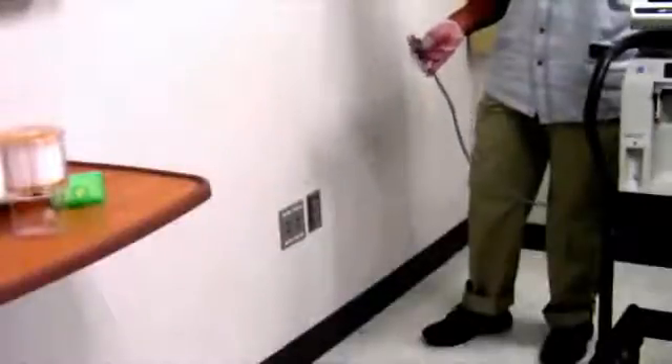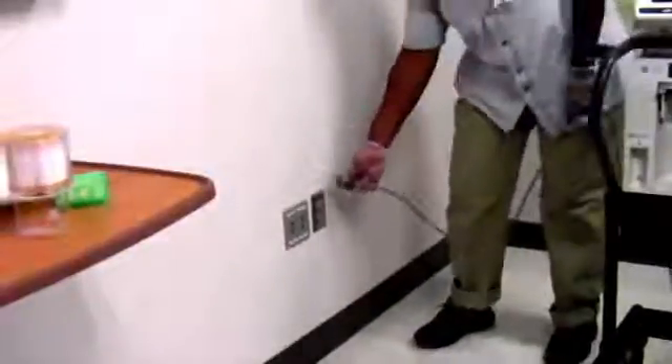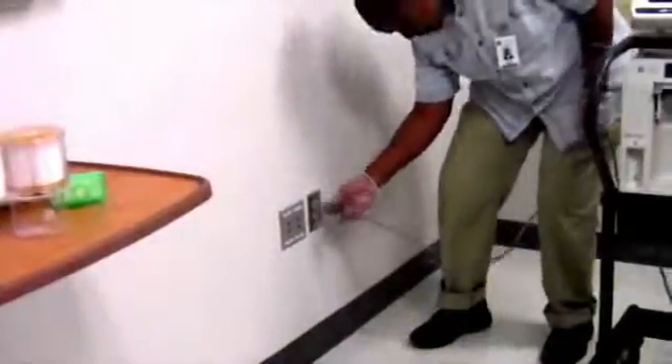You will start by plugging the ventilator power cord to AC power. To avoid electrical shock hazard, connect the ventilator power cord into a grounded AC power outlet.